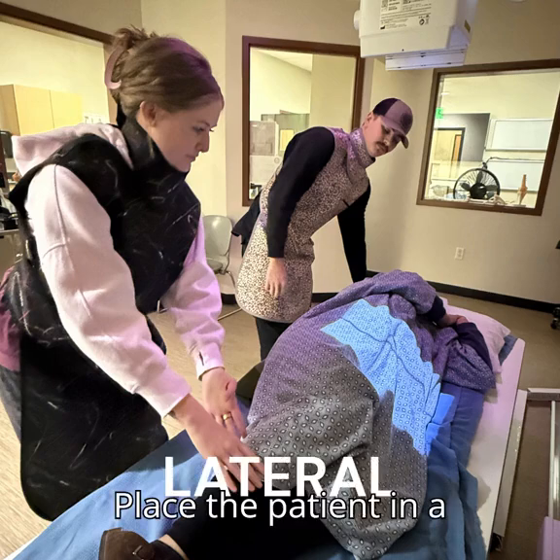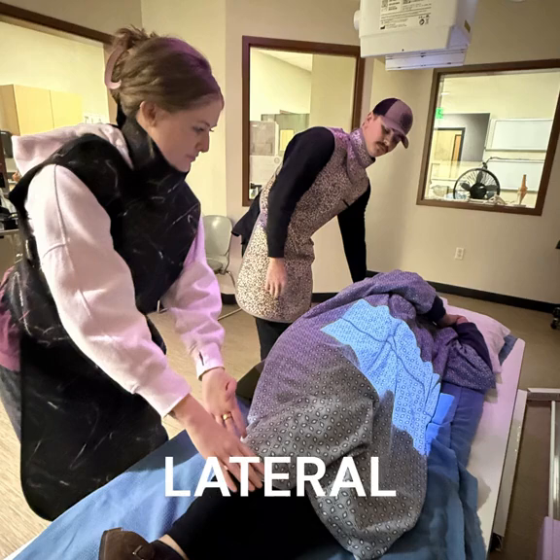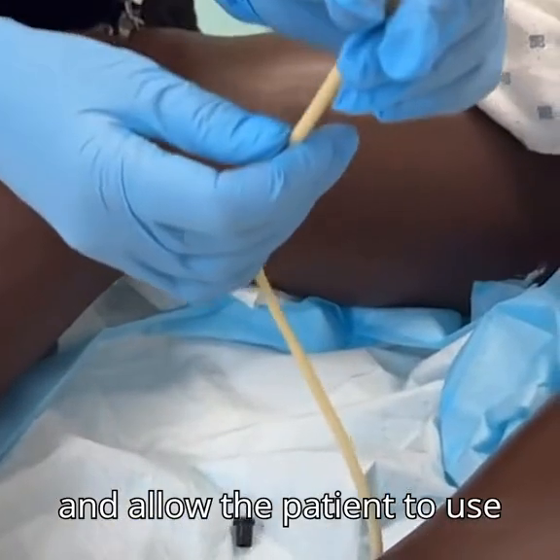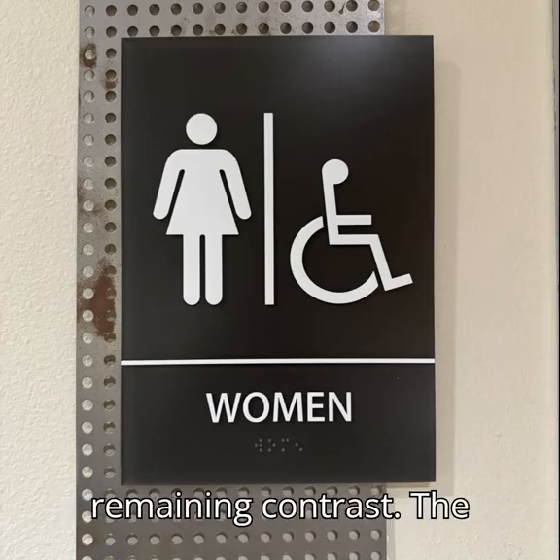Place the patient in a lateral position. Carefully remove the catheter and allow the patient to use the restroom to eliminate any remaining contrast.